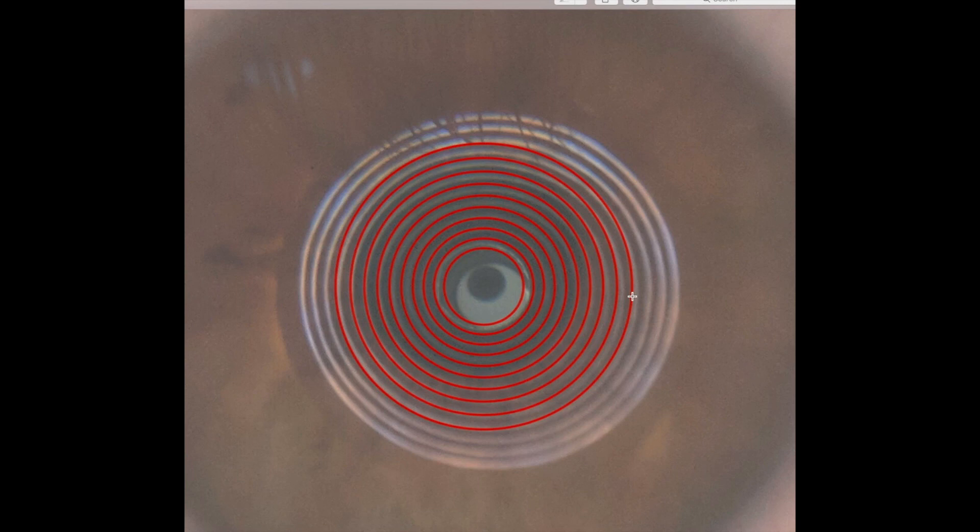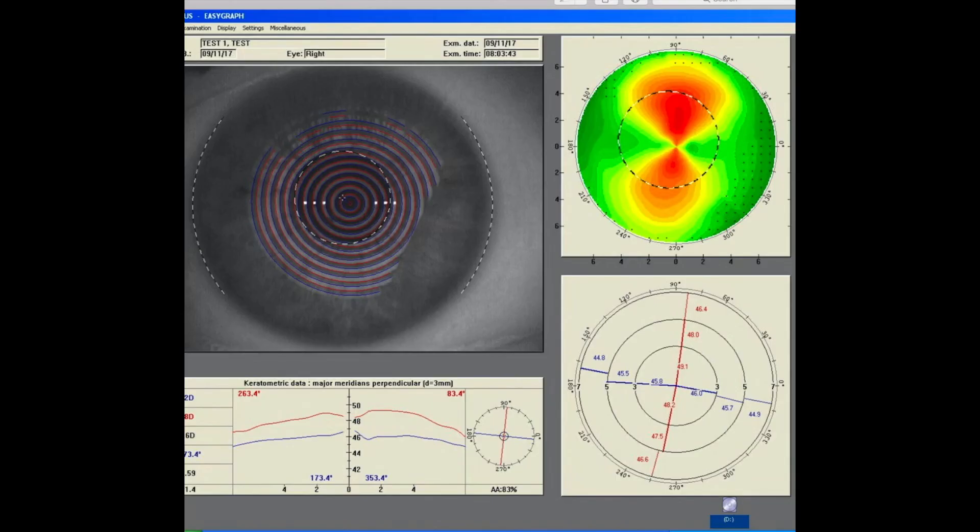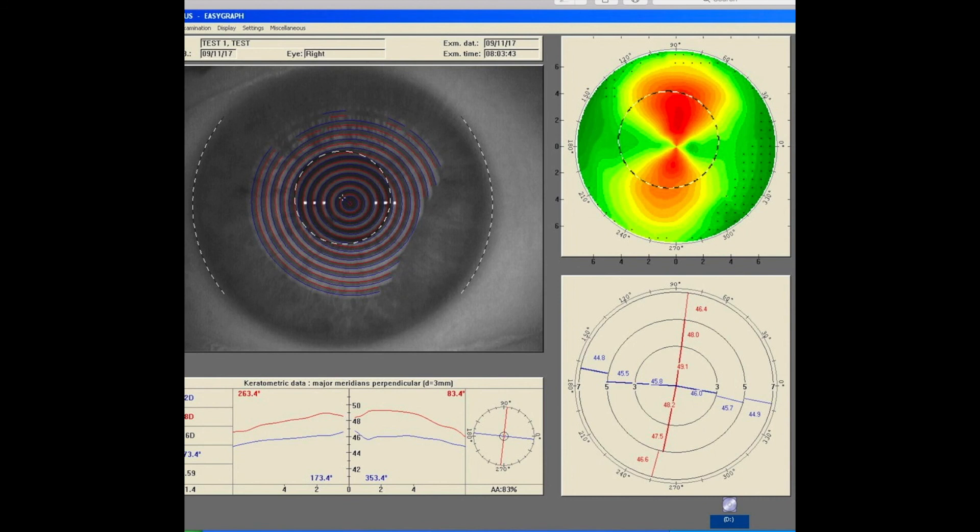And how much? Well, this is the corresponding topography. And it shows actually where the rings are being measured, the SimKs only show about two and a half, 2.6 diopters of cylinder. So the device is actually fairly sensitive. So I'm going to go back here, and you can see that. And this is how to interpret the photokeratoscope images. Thank you very much.